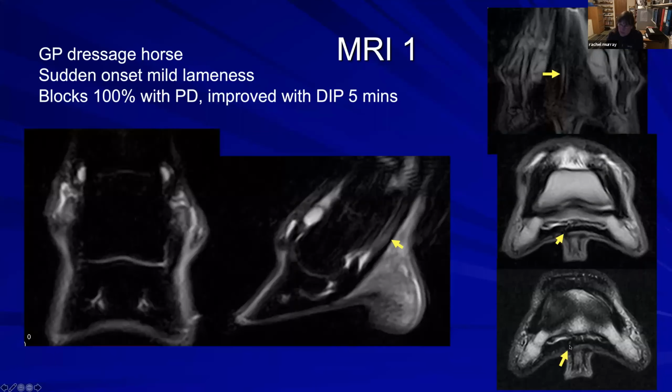It's evident as high signal intensity on T2 fast spin echo images. It might be that this is necrotic, and it might be that this is a recent injury. But either way, this is probably likely to have clinical significance. It also involves the dorsal margin here.